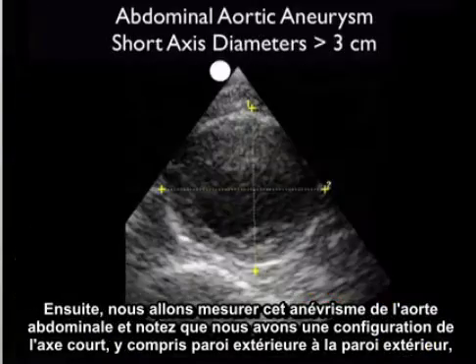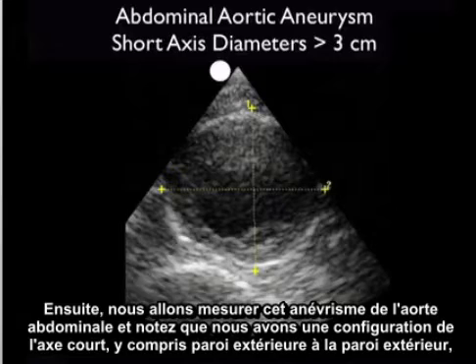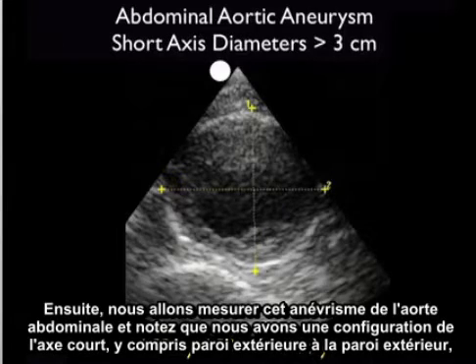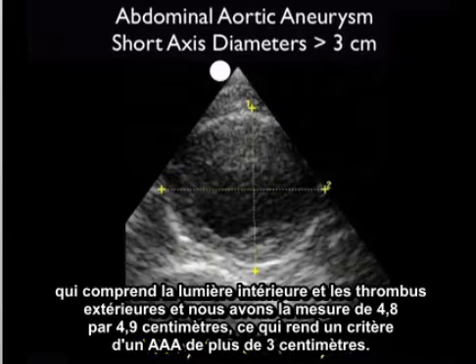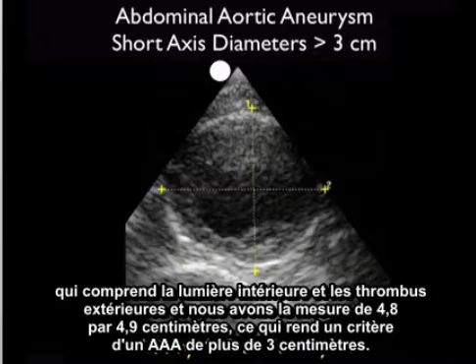Next, we're going to measure this abdominal aortic aneurysm. Notice we have a short axis configuration including outer wall to outer wall that includes the inner lumen and the outer thrombus, and we have a measurement of 4.8 by 4.9 centimeters, making the criteria of a triple A greater than 3 centimeters.